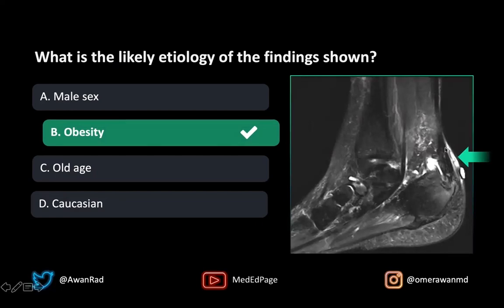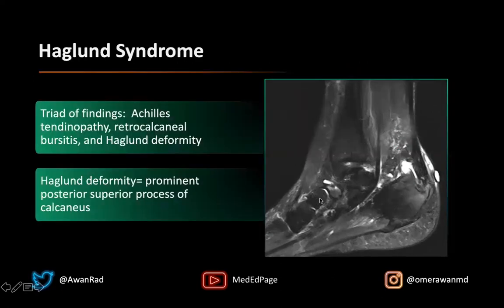We can see here again, just to show you: this here is the Achilles tendinopathy, this here is the retrocalcaneal bursitis, and then of course we have the prominent posterior superior process here of the calcaneus suggesting the Haglund deformity. So it's these three findings that suggest Haglund syndrome.